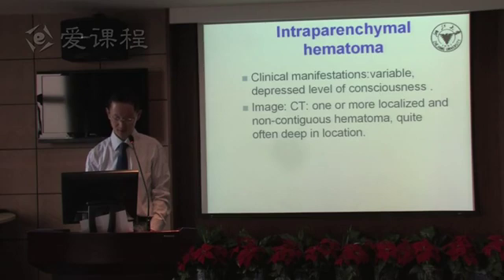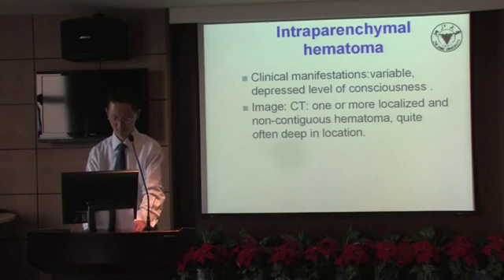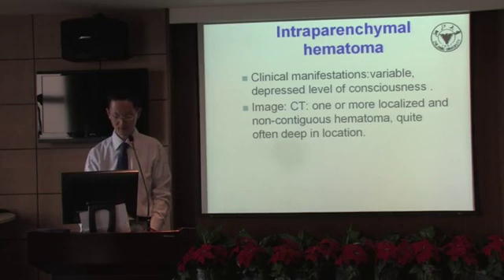After several hours, lesions that were not present initially or were just punctate hemorrhages can also enlarge and can be depicted on subsequent follow-up CT scan, the so-called delayed intracerebral hematoma.